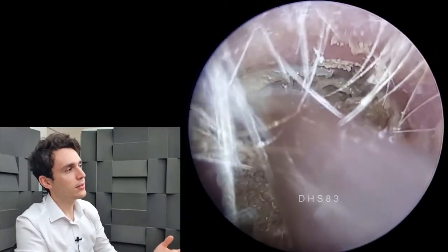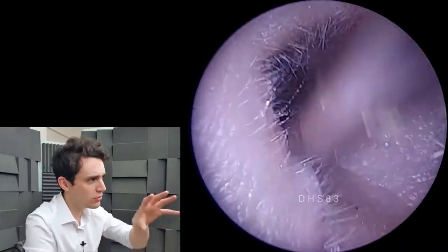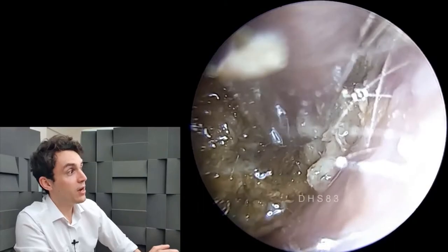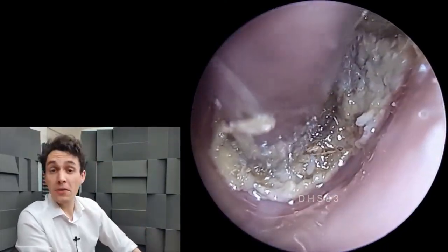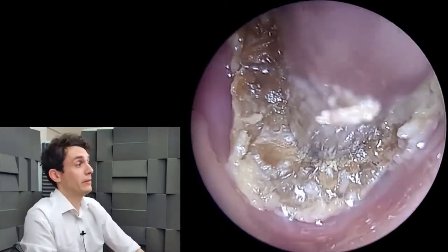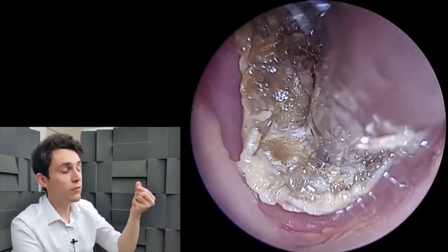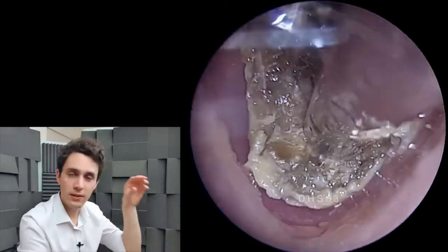What I'm going to show you is what's called a Clearway suction handle, or Clearway suction probe. I'm trying some olive oil here desperately just to make some progress, but I saw this online. It's made by a company called DTR Medical in the UK. I emailed the company and they very kindly sent me a free sample to try out, so thank you very much DTR Medical. It's a very interesting concept — it is a normal steel suction probe but with a very soft silicone tip on the end, very similar to the suction cup of an octopus or like an elephant trunk.